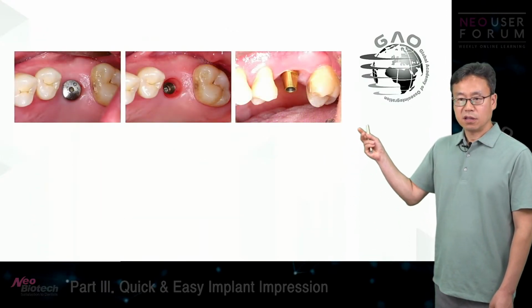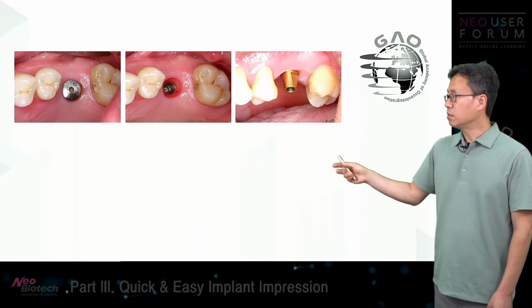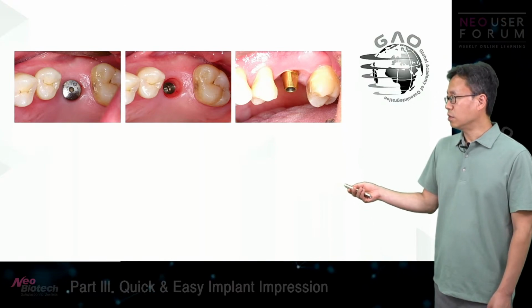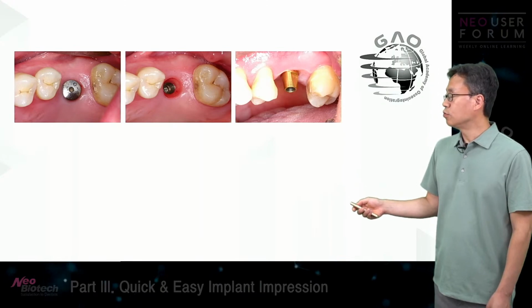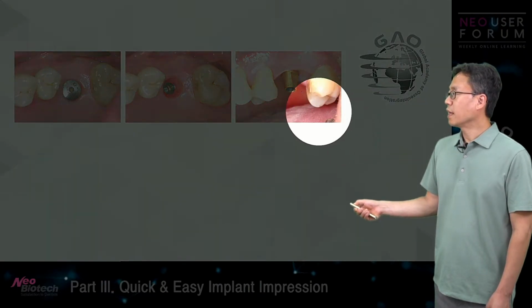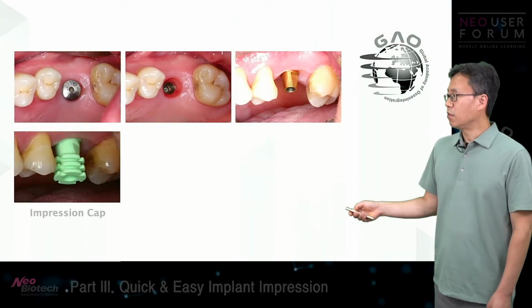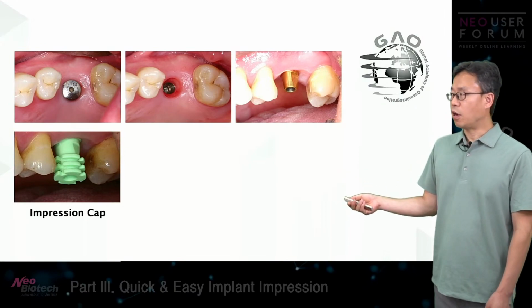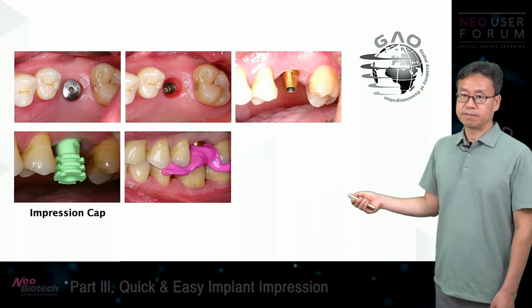After the implant is through the healing period, when someone's trying to take an impression, he or she just needs to connect one of the stock abutments like this, and then put an impression cap on and take an impression.